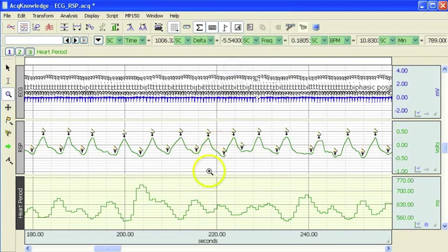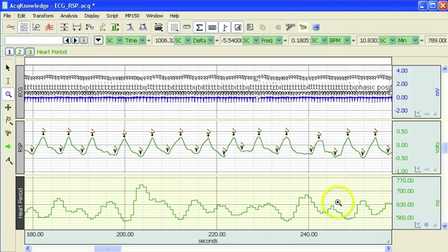And then during the expiration cycle we are actually going to be looking for the maximum R2R interval. And this is displayed, if I auto scale this, this is our R2R interval and this is in milliseconds.